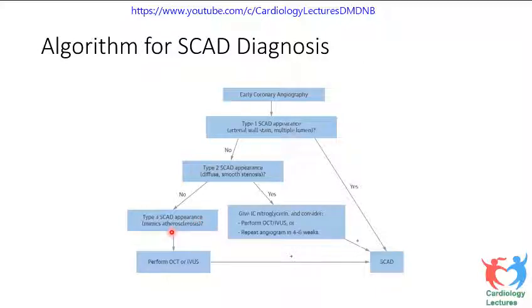But it is not a must that you should do imaging in all SCAD, because entering the true lumen might be difficult. And if there is a need for intervention or if there is a clear doubt in diagnosis, then you can do an OCT, or IVUS, then you can come to a conclusion easily.